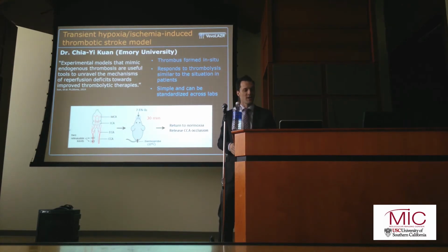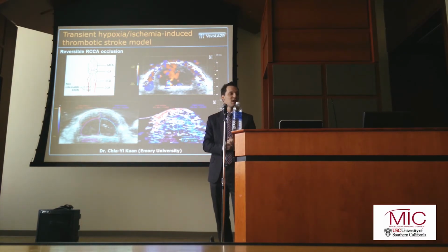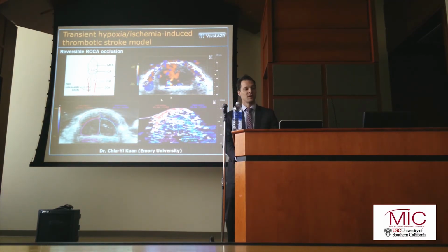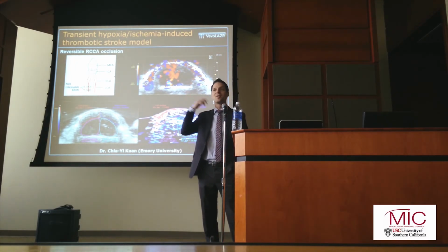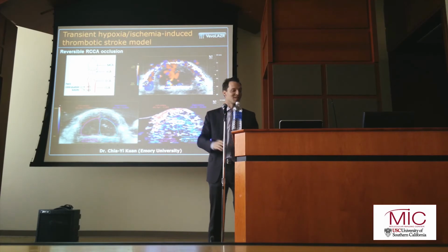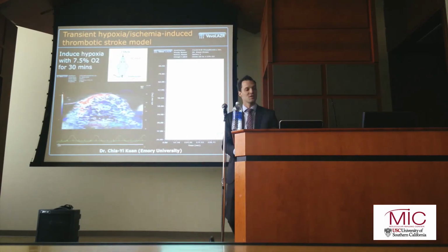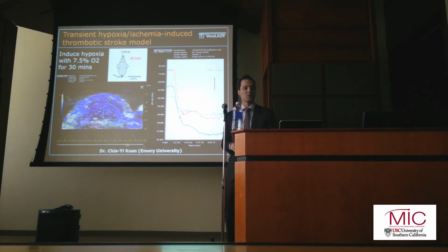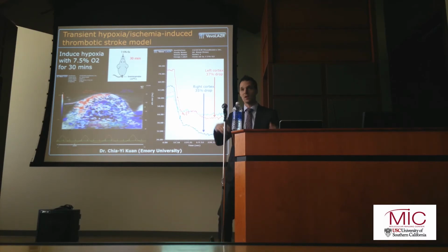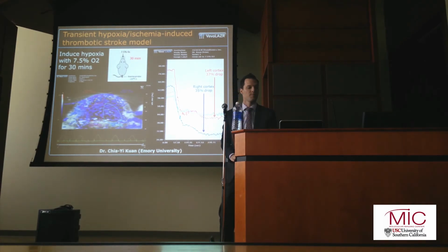So they've developed this model of ischemia, and they came in and we did the surgery, and we saw obviously differences when you occlude the common carotid artery. Not surprisingly, you see, with the right common carotid, changes in the flow in the right side of the brain, and changes in oxygen saturation in the right side of the brain. And then we turned the oxygen down, and sure enough, you see decreases right across the whole brain because there's less oxygen getting in there.